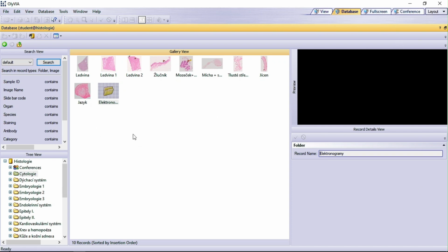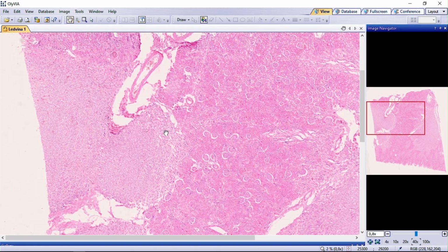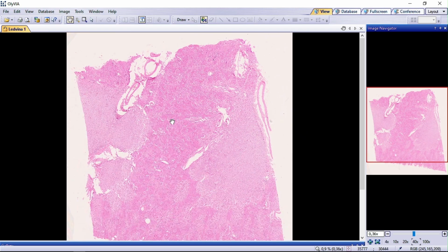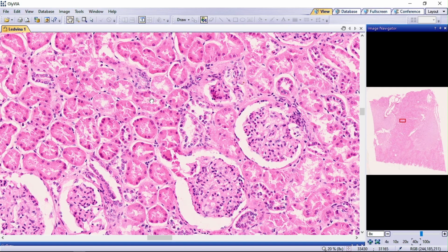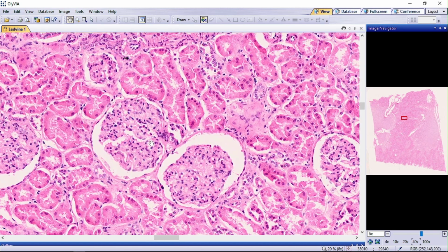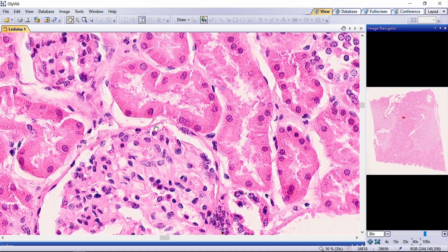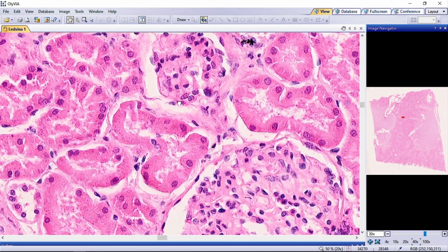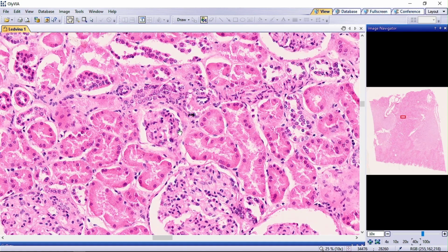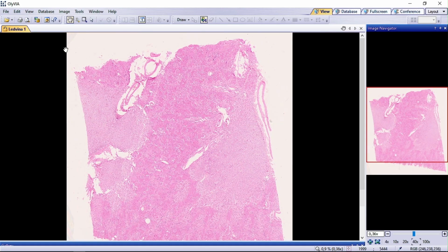This is your working space. You can click on each specimen as you wish. In the left lower corner there are chapters, sections for each type you want to go through: bones, tissue, muscles, etc. You can zoom in to the same level as you would on a microscope, and as I've already mentioned, the main advantage is basically that you've got a bigger screen. You can take a wider look at the whole specimen.